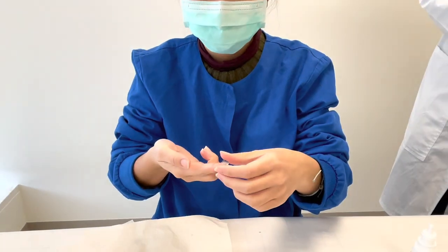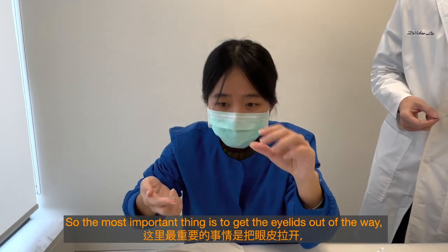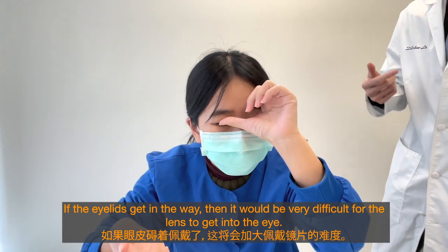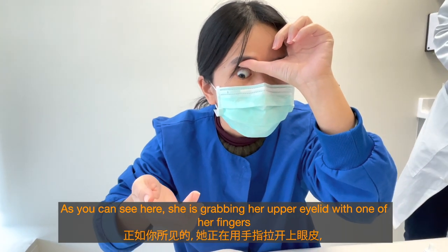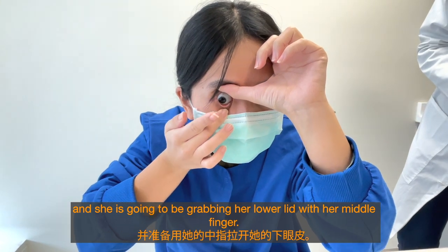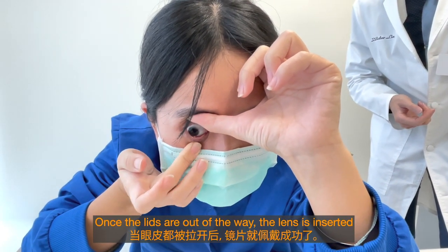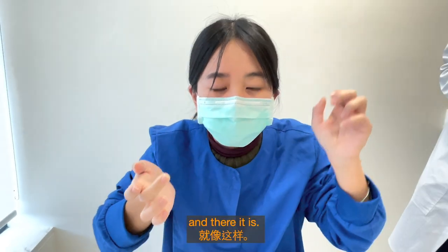The most important thing is to get the eyelids out of the way — both the upper lid and the lower lid. If the eyelids get in the way, it'll be very difficult for the lens to get into the eye. She's grabbing her upper eyelid with one finger and the lower lid with her middle finger. You want to get close to the mirror so you know where you're placing it. Once the lids are out of the way, the lens is inserted — and there it is.